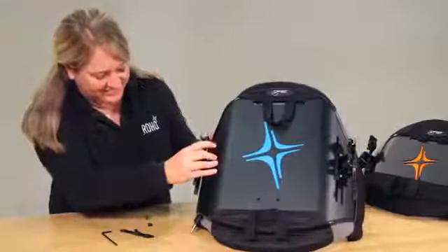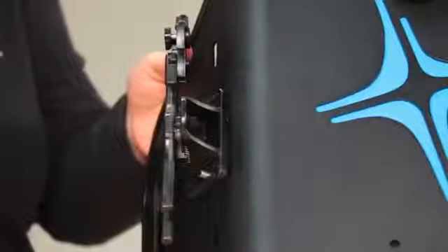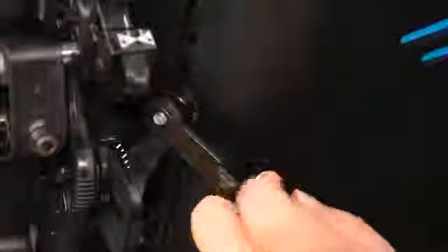With the left and right back shell hardware positioned at equal heights, tighten the nuts so that they are snug enough to hold the hardware in place. Tighten the nuts on the width and height adjustment bolts with the box end wrench until snug, plus a quarter turn. Once adjustment is complete, make sure all hardware is securely tightened before the individual is seated in the wheelchair.